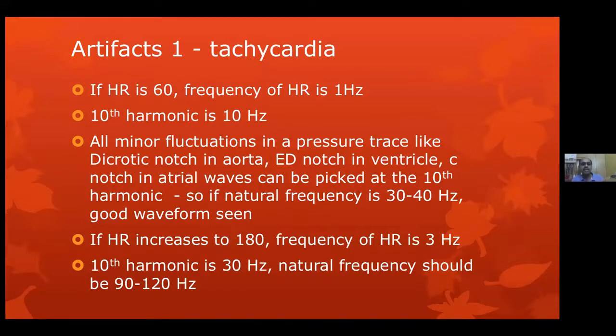Connect a 3-way, connect the mercury manometer to the side arm, keep inflating, turn the 3-way now towards the transducer and see whether you are able to get 100 millimeters of mercury. But this is not the recommended method. The recommended method is that there are inbuilt mechanisms in each and every transducer. It will automatically give 50 and 100 the moment you put the auto calibration on.